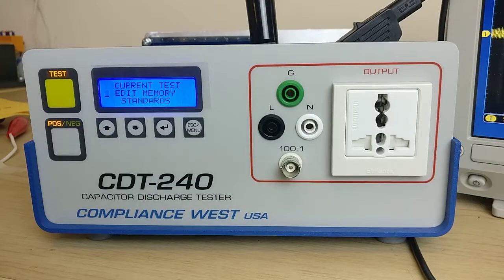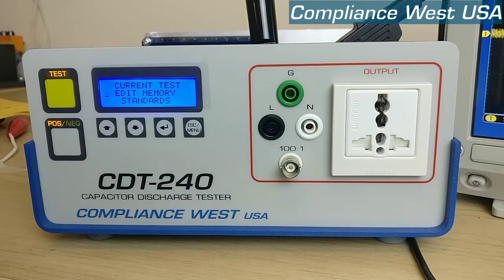Hi, on this video we're going to show you how to perform section 9.1 of the calibration procedure for the CDT240B2.